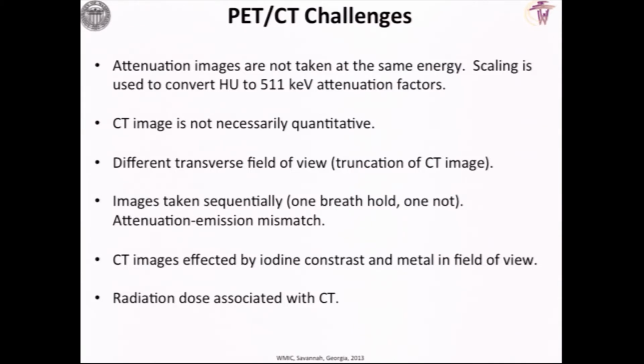There are different imaging fields of view. One of the issues has been that there could be truncation of the CT image. In general, because the CT images are taken so quickly, you have people lift their arms above their head so their arms aren't in the field of view. With the PET images, sometimes you can do that. Other times, when you're doing whole body studies, because of the length of the study, you keep the arms in the field of view. So the fields of view of the CTs, in general, have not been as big as the field of view of the PET images.